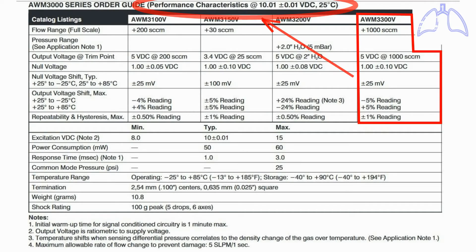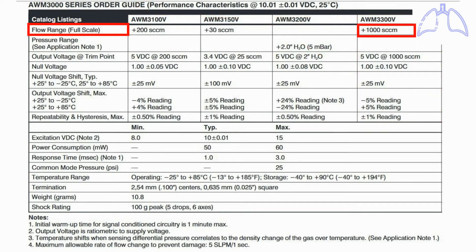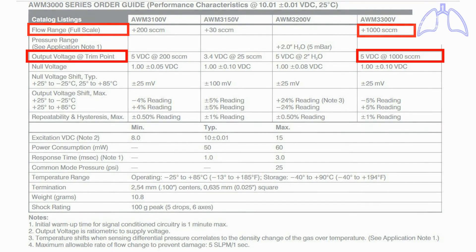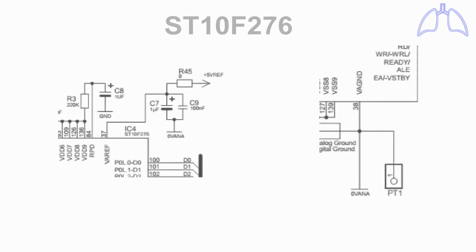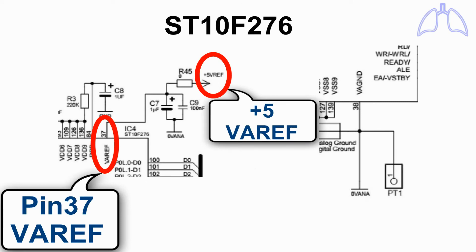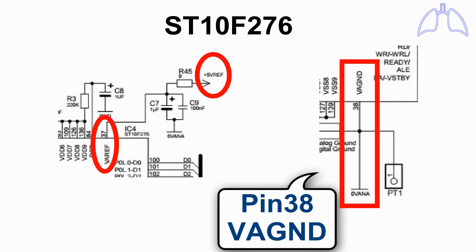These are the performance characteristics of the flow sensor at 10 volts supply voltage. The maximum flow is 1,000 standard cubic centimeters per minute, and its corresponding output voltage is 5 volts DC. In the ST10F276 microcontroller, pin 37 is connected to 5 volts as an analog reference, and pin 38 is connected to 0 as an analog ground. So the analog input voltage range is from 0 to 5 volts.